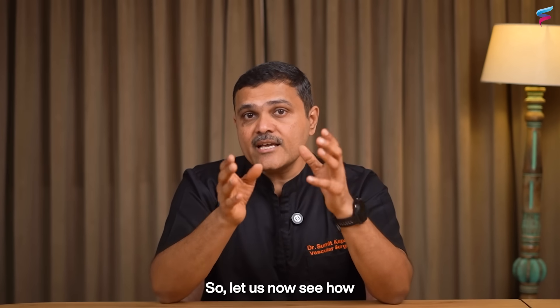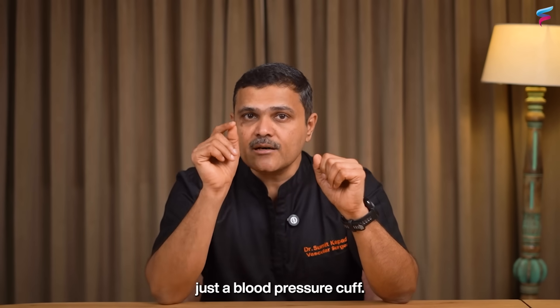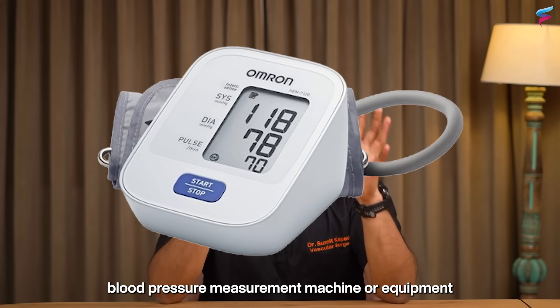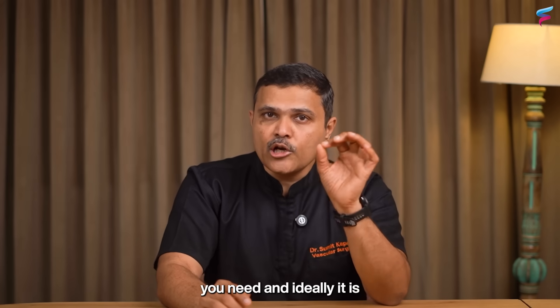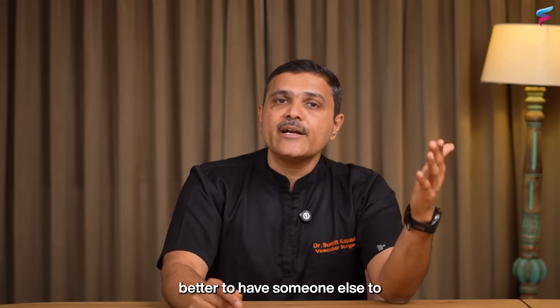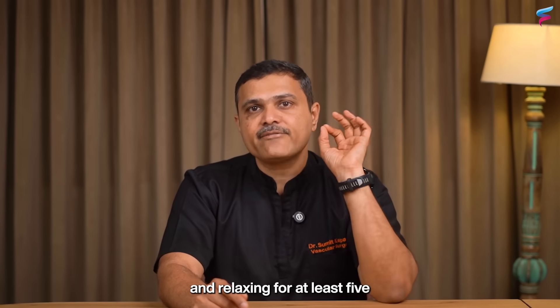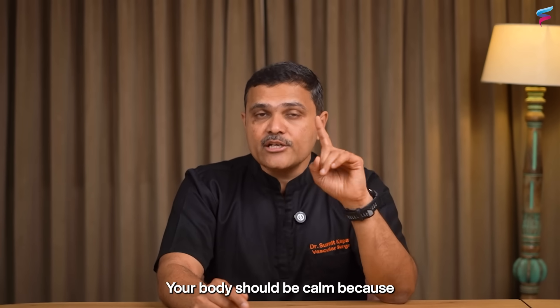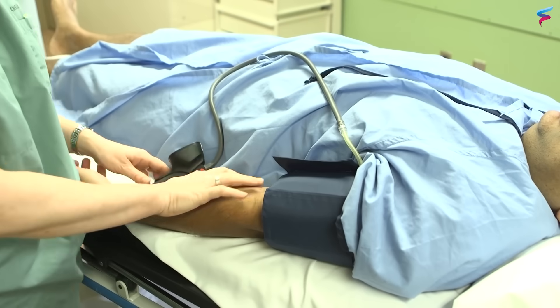Let us now see how to check ABI at home with just a blood pressure cuff. Many of us already have a blood pressure machine at home — that is all you need — and ideally it helps to have someone assist you. Start by lying down and relaxing for at least 5 minutes. Your body should be calm because stress or recent activity can affect your readings.